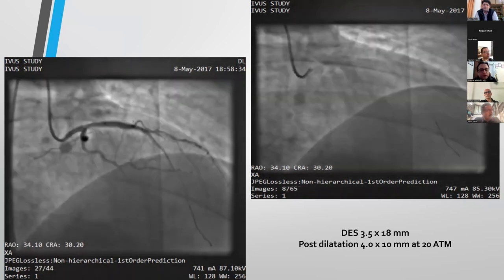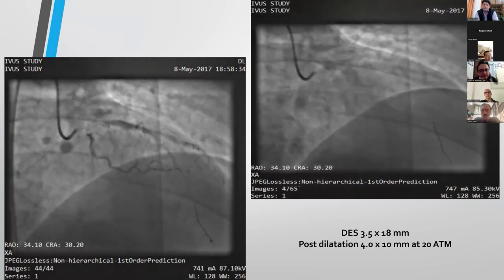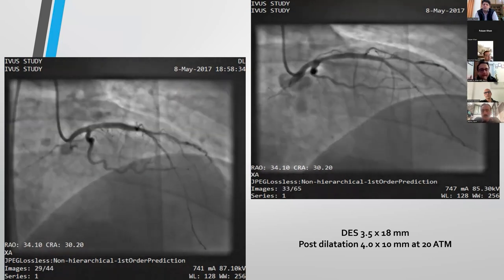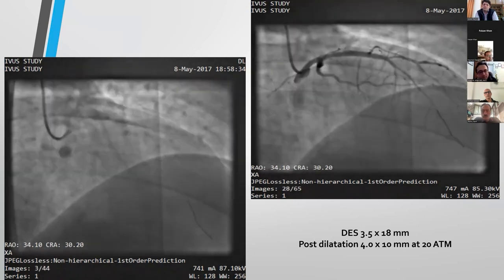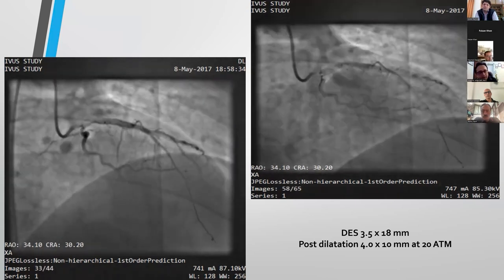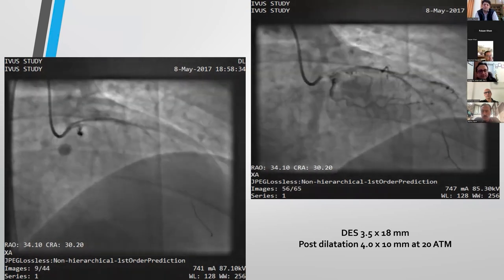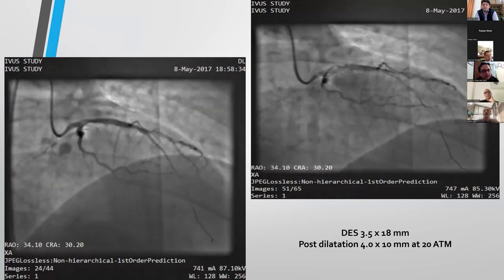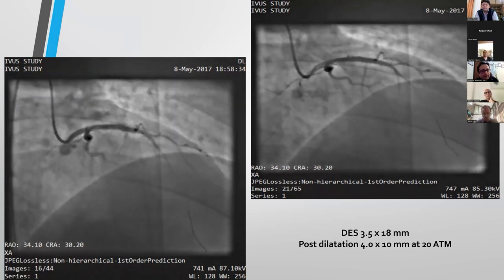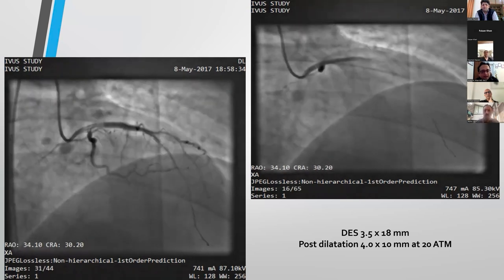But if you are not able to expand that original stent, even if it fractures, at that point in time you can always put in a new stent. But if you are not able to expand it and then you put in a second layer of metal, that's probably something. It looks like a fantastic result, so I'm sure it expanded. An IVUS in the middle, before putting in the second stent, would really have helped make your case. But this looks like it has expanded.